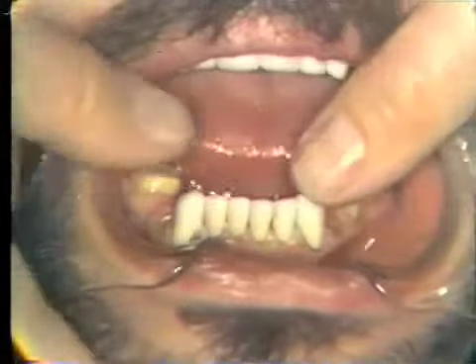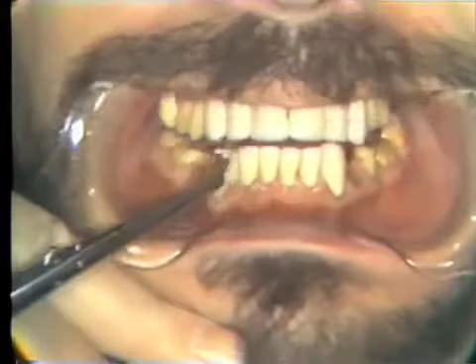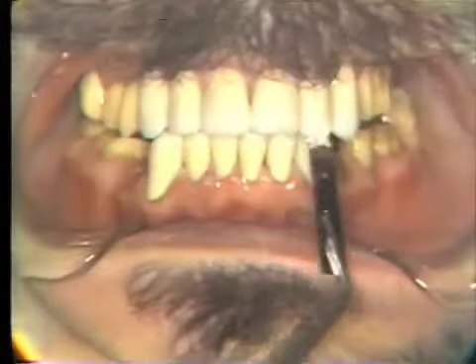Now that we've got all the restorations in, the contacts adjusted, we can go ahead now and check our occlusion. First thing we'd want to establish is good centric contacts, so we would check to make sure that we've got good contact between the teeth. Close, open, close on the back teeth. Okay, we've got good contact on that one. Open, please, close. Light there, close. Open, close. So we're a little tight on the canines and a little bit light on each of the centrals. So we can check to see where we're contacting. Close, please. Tap, tap. Open, close.